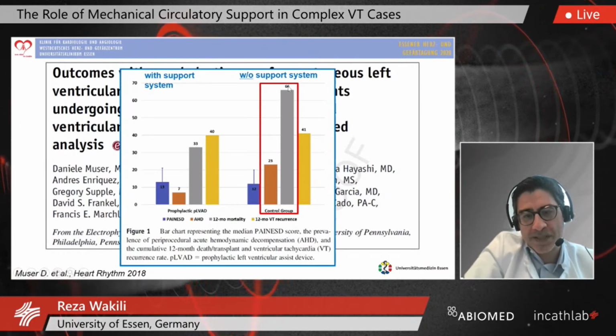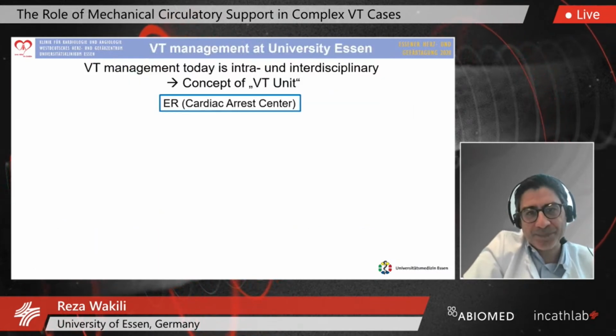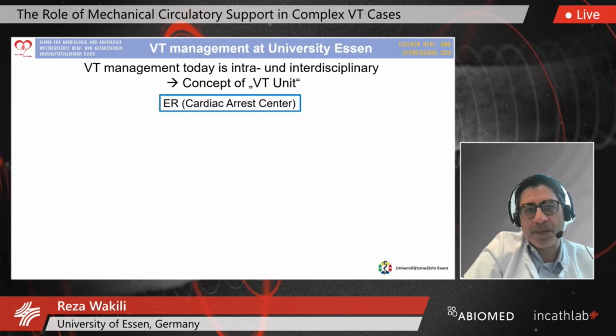This also encourages that patients with a high risk should really be considered for a support system. Now, as I already mentioned, we think that VT management today is intra- and interdisciplinary, with the concept of a VT unit.